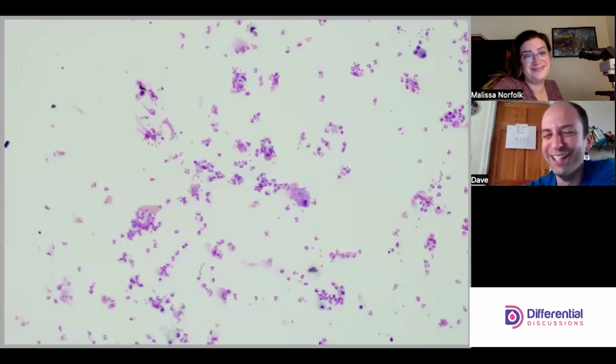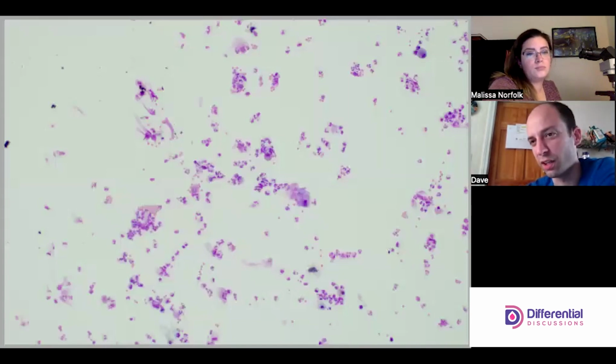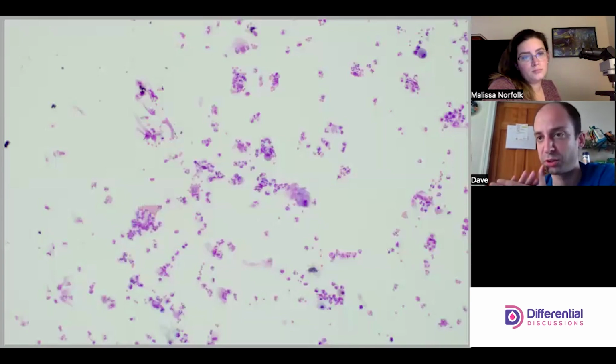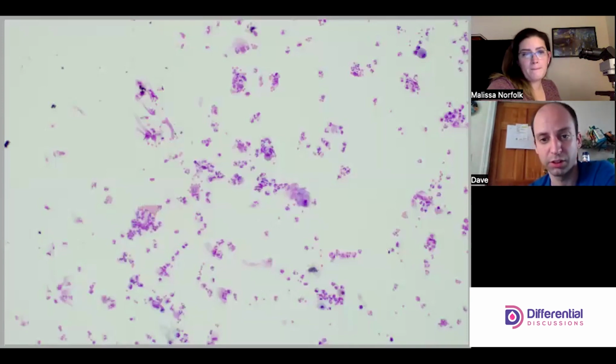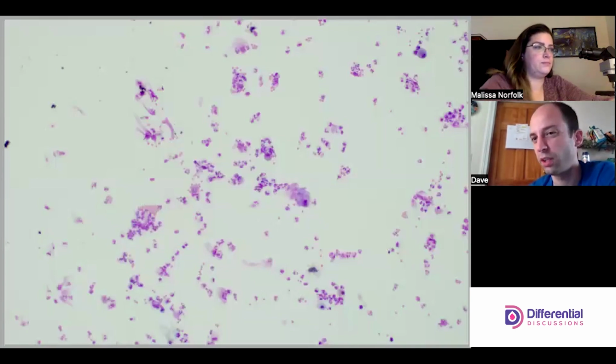So this process, from my understanding, is essentially flushing saline into the lungs, into the alveolar space, and then sucking it back up. So it's twofold here. It's therapeutic in that it's debriding and getting junk and cells and maybe even infectious organisms out. And then diagnostically, you can see what that stuff is, right? And we can do cell counts and do diffs. Making slides is usually quite difficult because of the mucus that's associated with these.